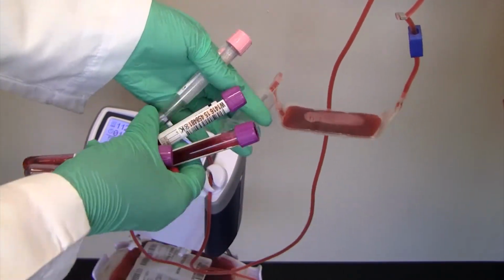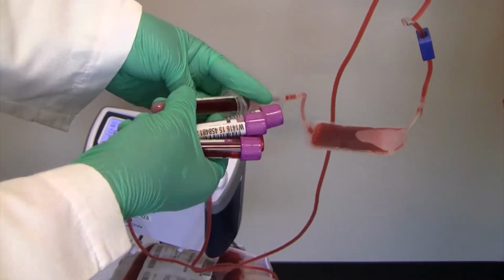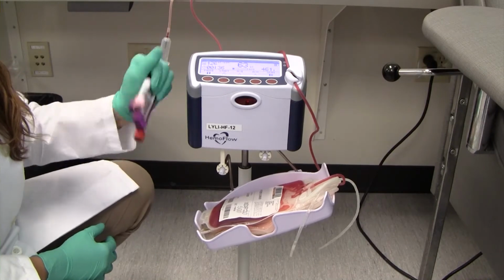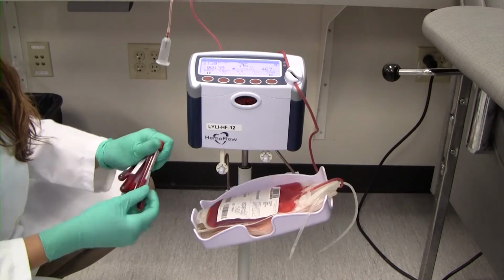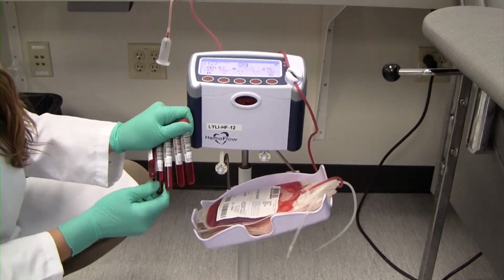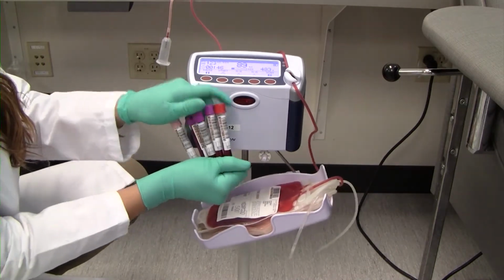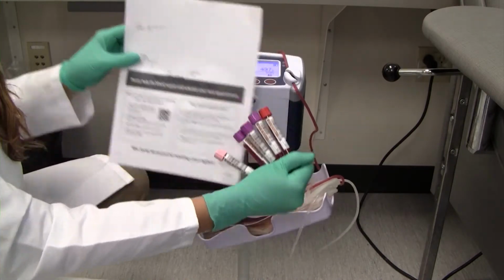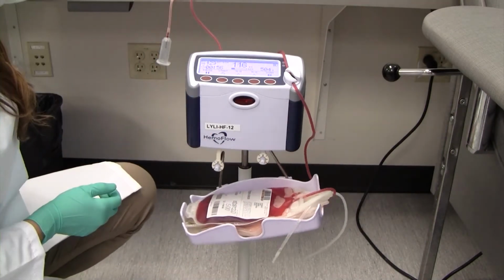Close the lid on the vacuum tube holder after the final sample collection. Invert tubes containing an additive at least 8 times. Re-identify the sample tubes immediately after filling by ensuring the DIN on the tubes match both the DIN on the collection bag and the printed DIN on the donor sheet. Keep sample tubes at bedside with donor sheet.